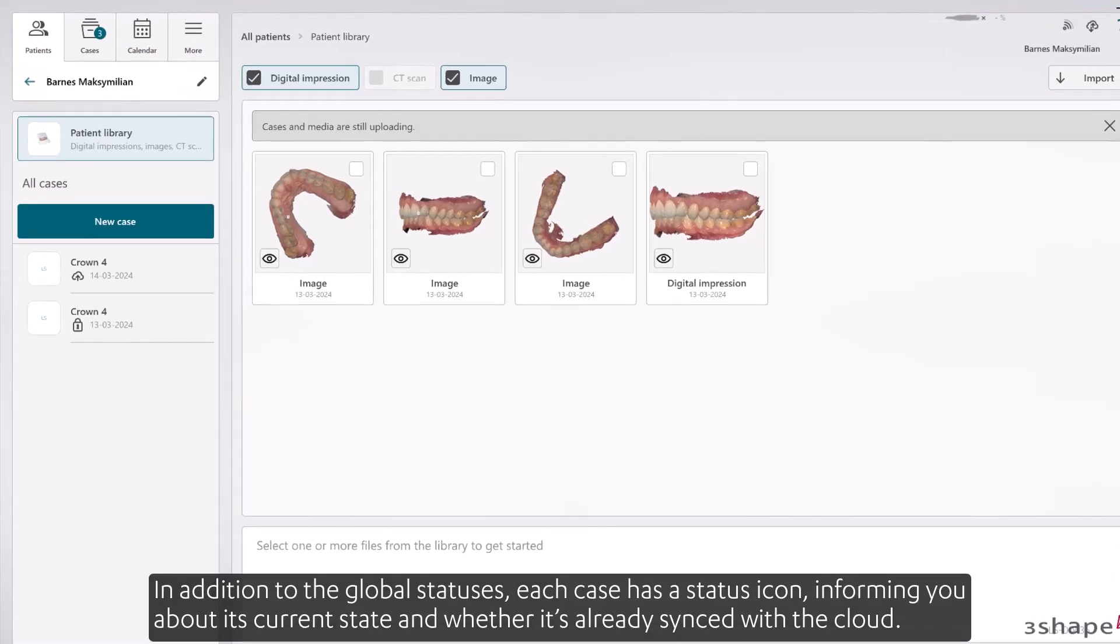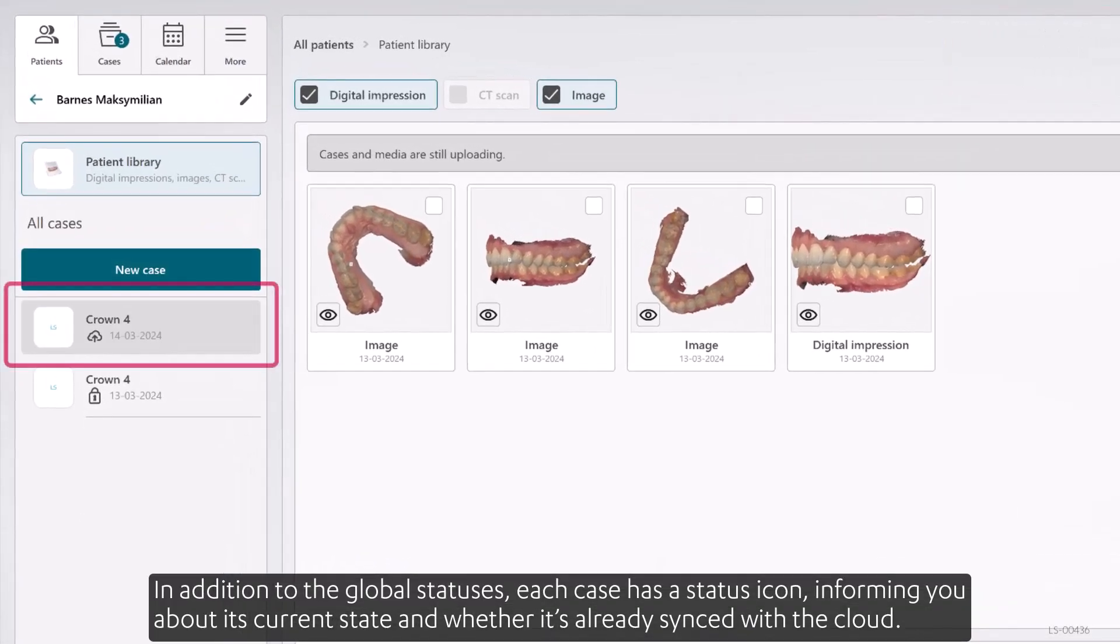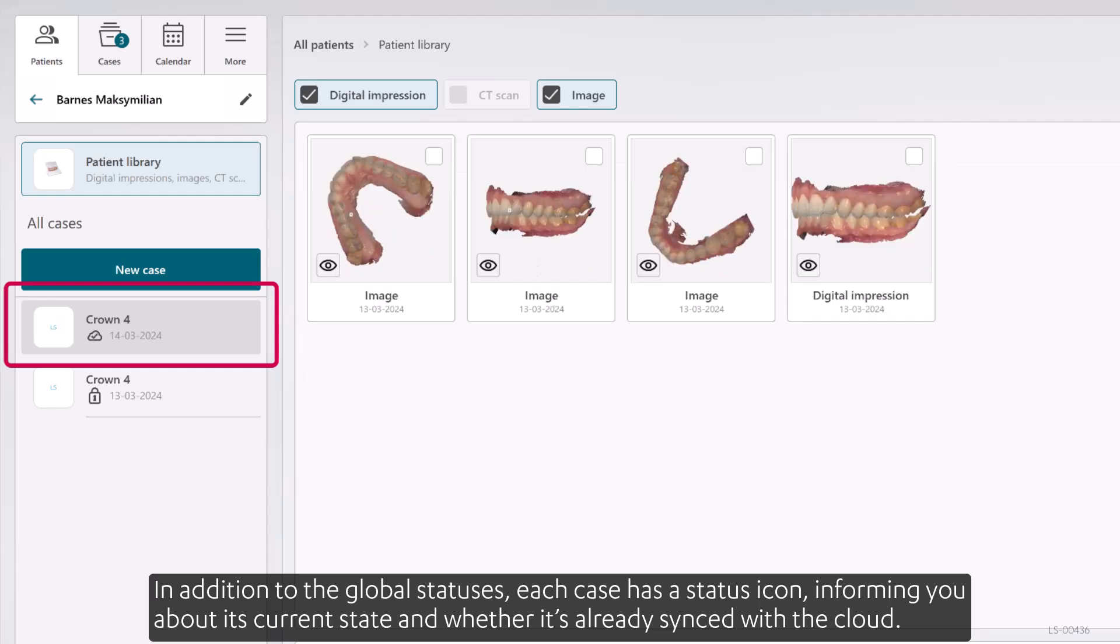In addition to the global statuses, each case has a status icon, informing you about its current state and whether it's already synced with the cloud.